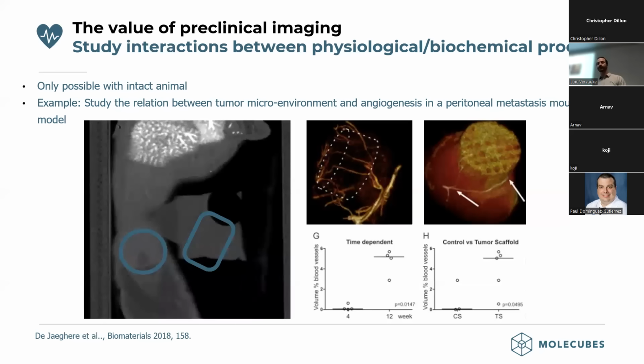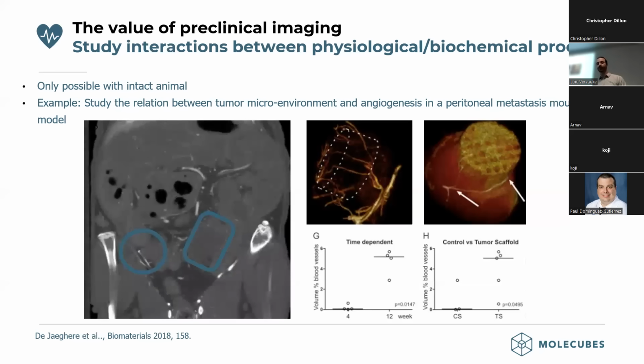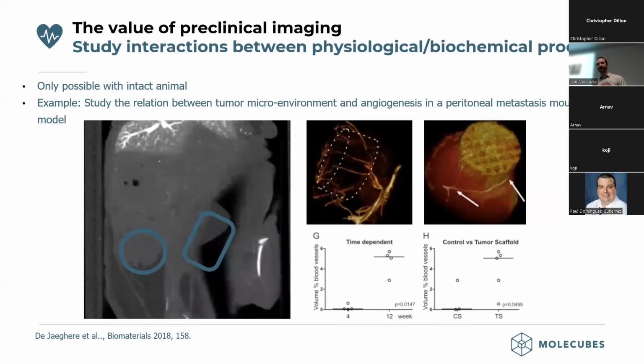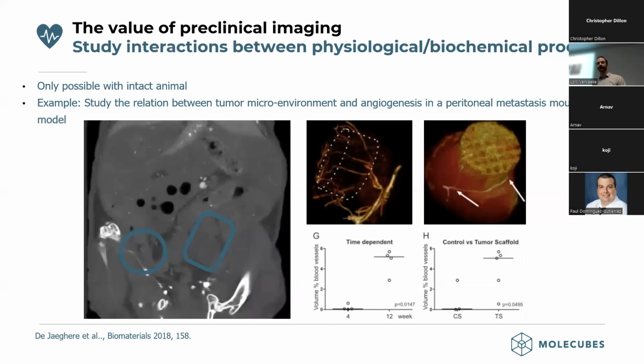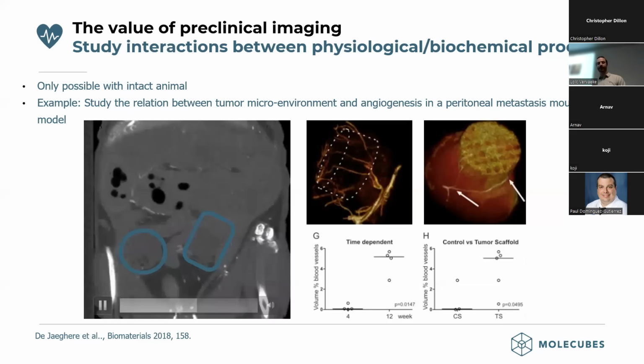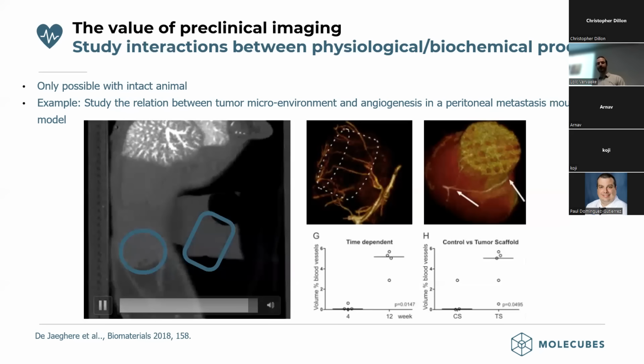And then afterwards, what they then could do is over time basically have a look at the effects of this environment on the angiogenesis, the little blood vessels that were formed. This is here seen on the highlights of the small blood vessels with contrast imaging.